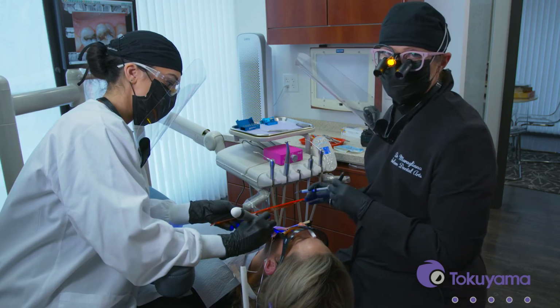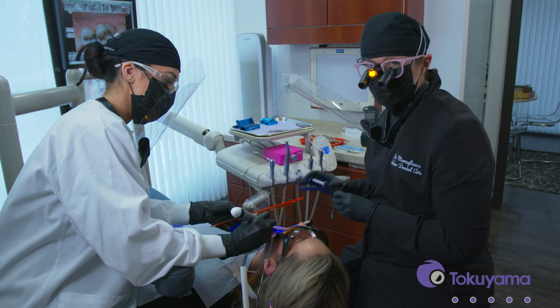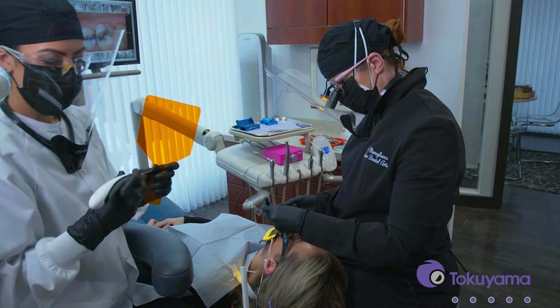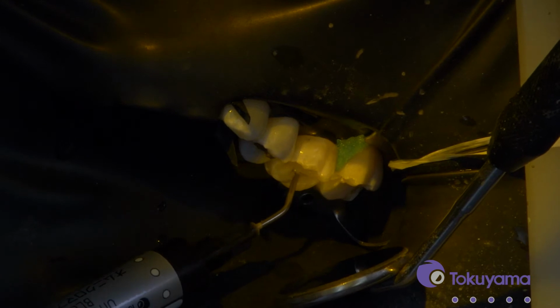It's important to pay attention to the intensity of your curing light. This is a material that, with my light, only needs to be cured for 10 seconds. And I see a couple of spots here that I'm going to add just a touch more. So we like Sarah here. We want her to leave with a gorgeous restoration.